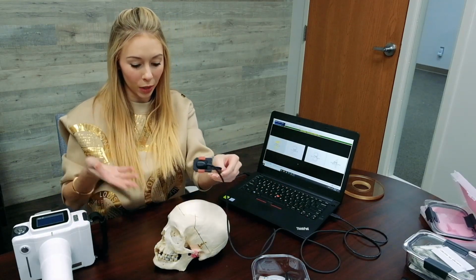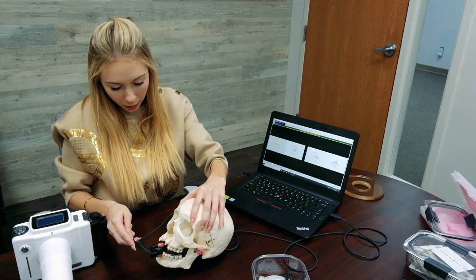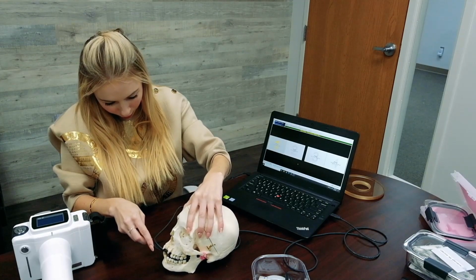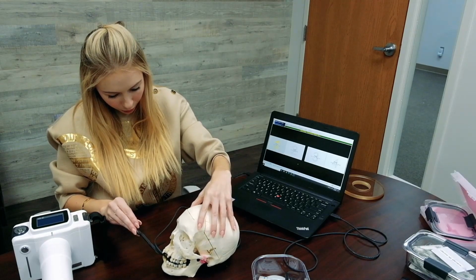So now Mr. Ed Bones here is going to help me with the bite wing series. I'm going to place this in his mouth all the way towards the back and have him bite down on the bite block. Mr. Ed Bones, go ahead and hold that for me as I take the x-ray series. There we go.